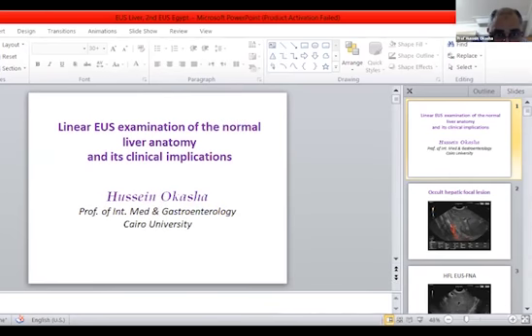But during percutaneous sampling, you pass through the skin, subcutaneous tissues, muscles, and also the peritoneum. So the incidence of seeding during endoscopic ultrasound is much less than percutaneous sampling.